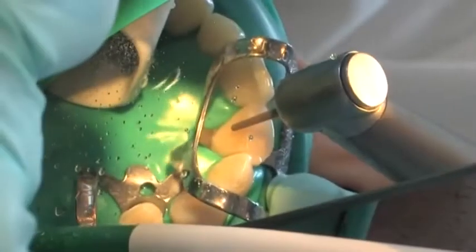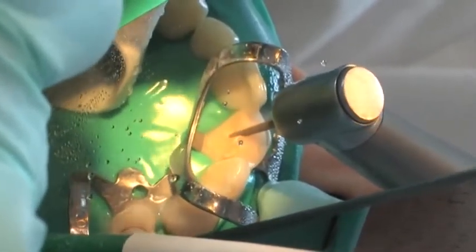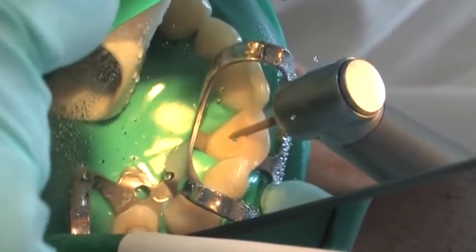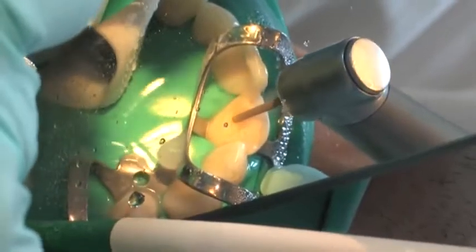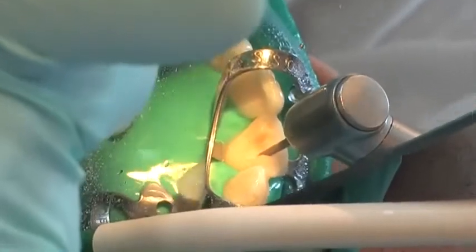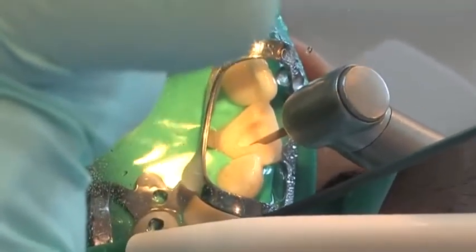The root canal is exposed from the palatal surface until contact is made with the root canal filling material, while removing as little tooth structure as possible. The appropriate diameter and length of the post can be determined using a radiograph. It is important that a sufficient wall thickness of at least one millimeter is preserved to prevent the risk of perforation or weakening of the root.